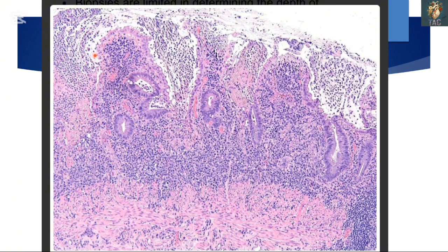You can see epithelium over here, which is not continuous, as it has been ulcerated at many places. Regarding the crypts, you can see there is branched crypt atrophy, and different sizes and shapes of crypts are there in this particular section. You can see chronic inflammatory infiltrate, which is consisting of plasma cells and lymphocytes. Paneth cell metaplasia will be appreciated in the basal area of these crypts.